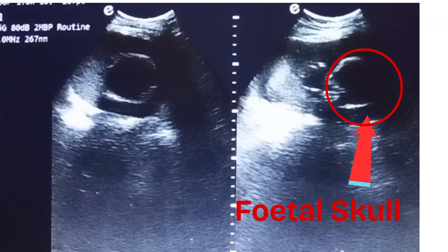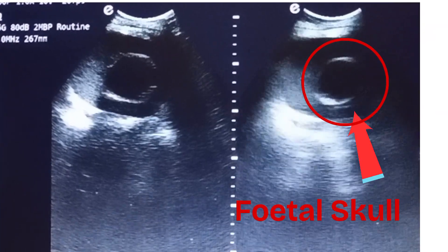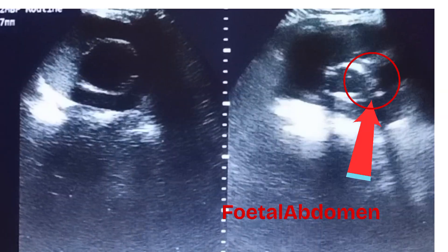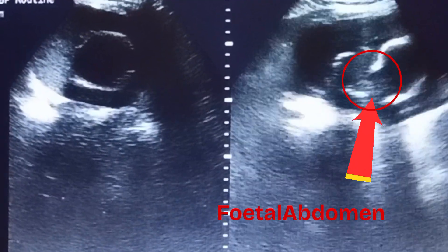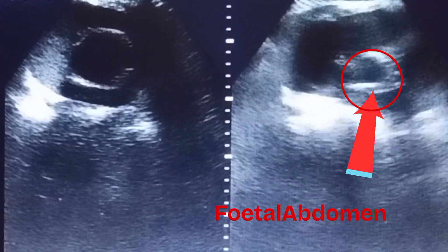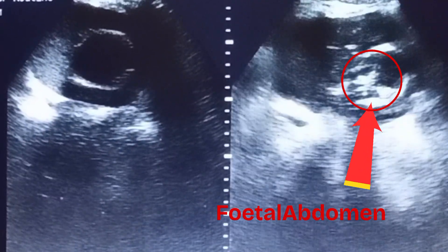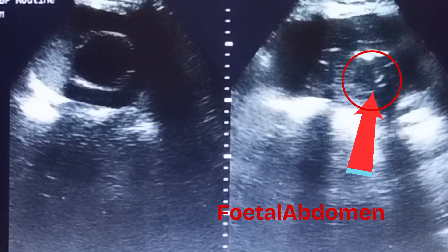Here again you can see the fetal skull bones, and here the fetal abdomen can be seen inside the red circle.